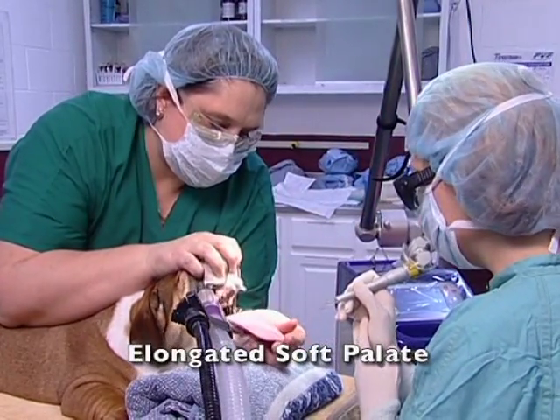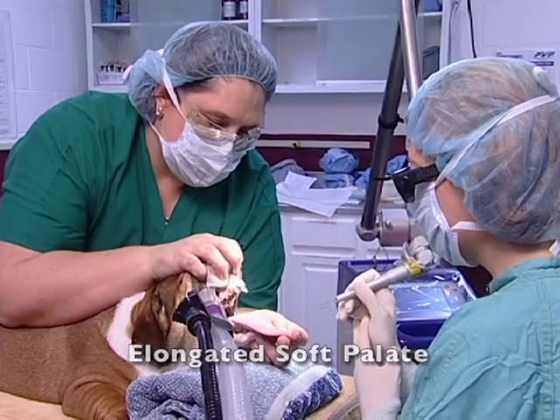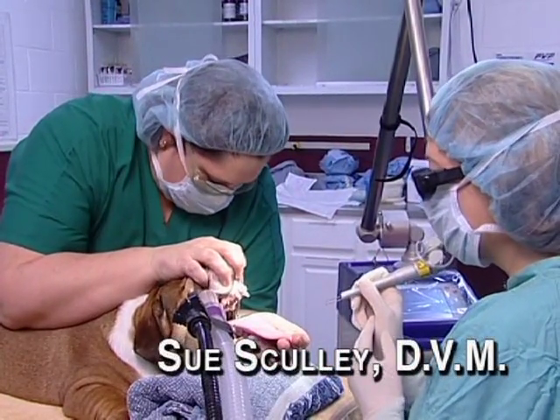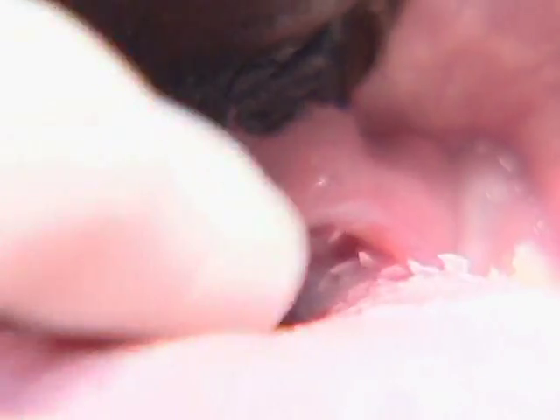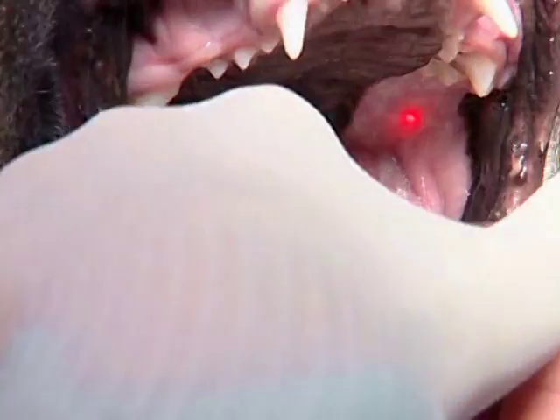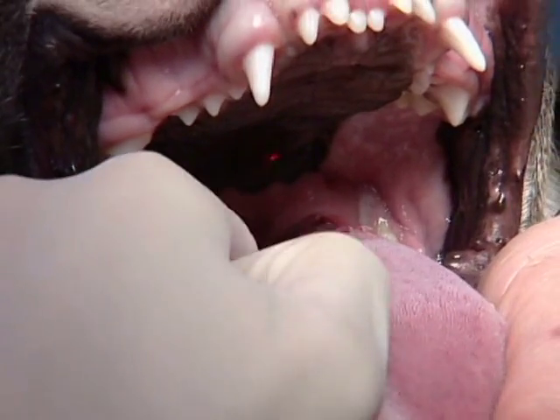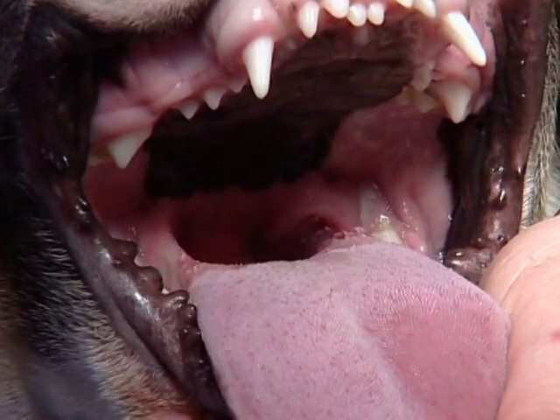Without a laser I would refer this procedure to the university. The first thing we're going to do is mark our palate so we know how much we can take. We use some easy landmarks — the tip of the epiglottis is one, so in between breaths we put a dot at the tip of the epiglottis.